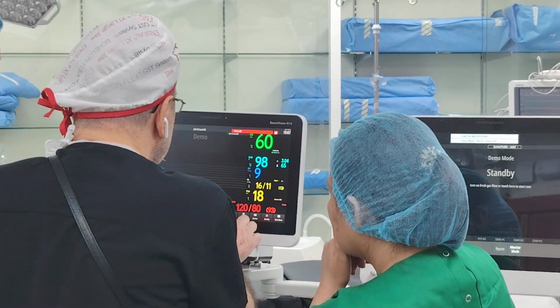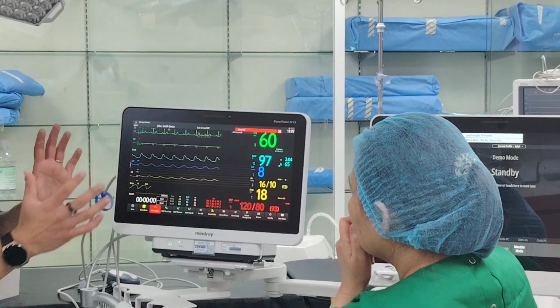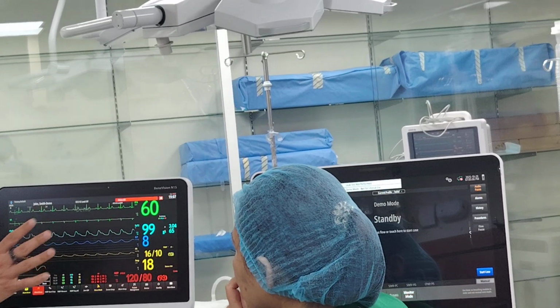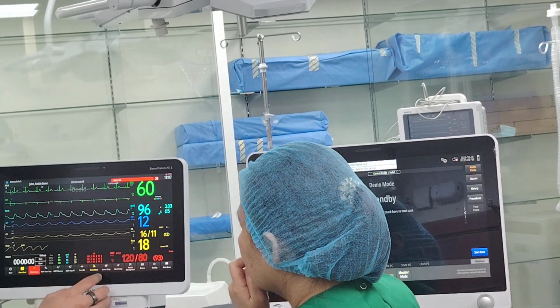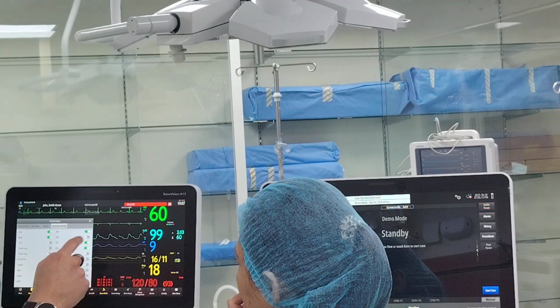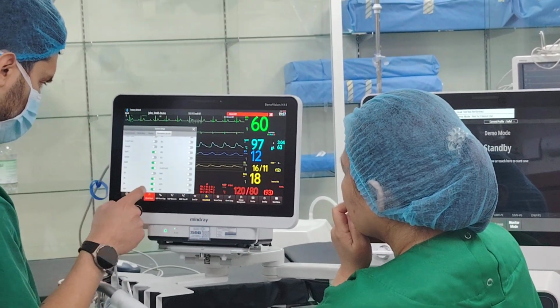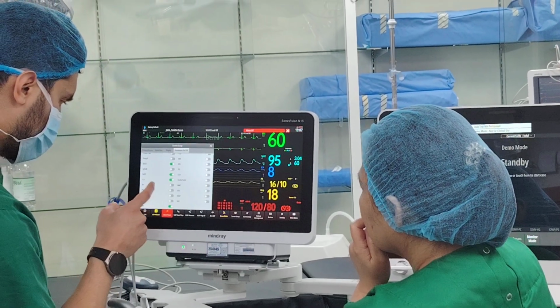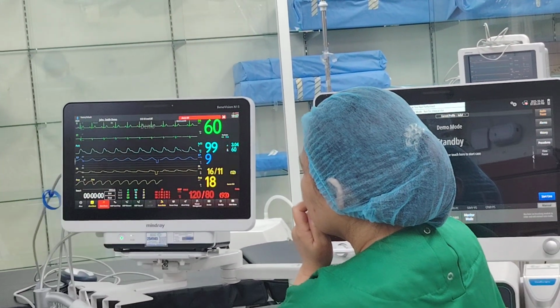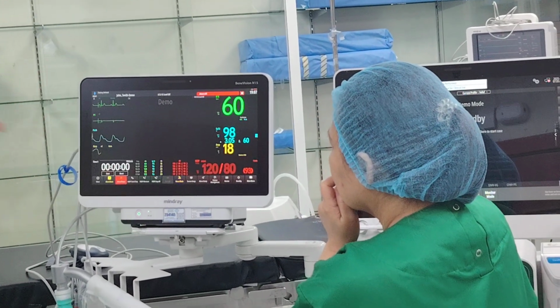Alarm set. No, the screen center here. But usually, I will tell you something: when I configure it for your doctor, you don't need to play around with it. Why? Because when you put CVP, it will show. You put arterial, no arterial line, this will go away. So let me take out all the pressures, the PA and all the measurements. Most important, for the rate, it will not show. If we need it, we can bring it back. So look, this is your basic.